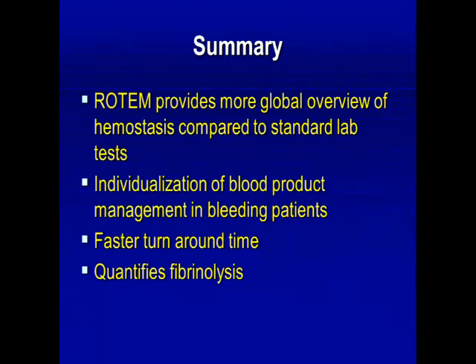And it provides a good quantitative assessment of fibrinolysis. So especially in obstetrics with the WOMAN trial, they used fixed dosing of TXA, so it's a gram and then repeat a gram in like half an hour. But previously there wasn't a way to quantify that. So you really have no idea if that gram actually worked, and you're just giving another gram afterwards. So this gives you a better way to tailor that treatment a little bit more towards the patient.